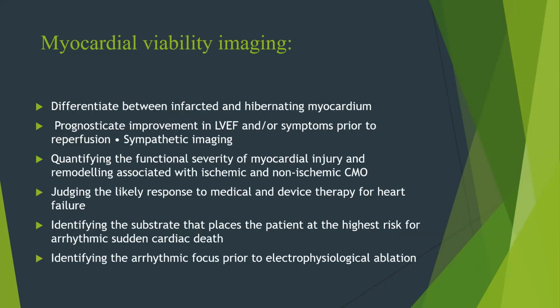Then we also do cardiac PET, in which we do myocardial viability imaging, which is helpful in differentiating between infarcted and hibernating myocardium. We can prognosticate improvement in LVEF and symptoms prior to reperfusion, and we can do sympathetic imaging also.